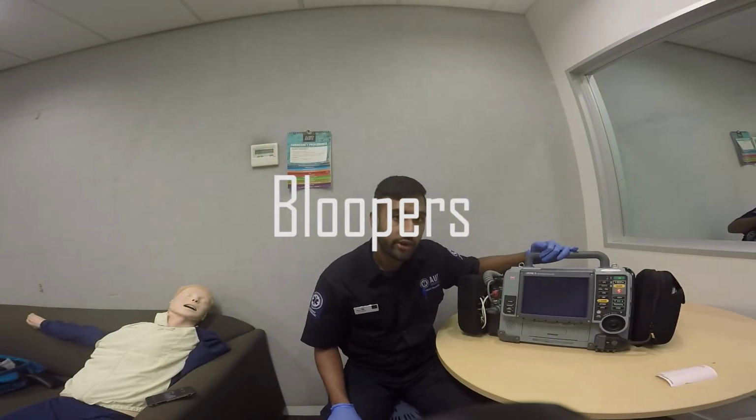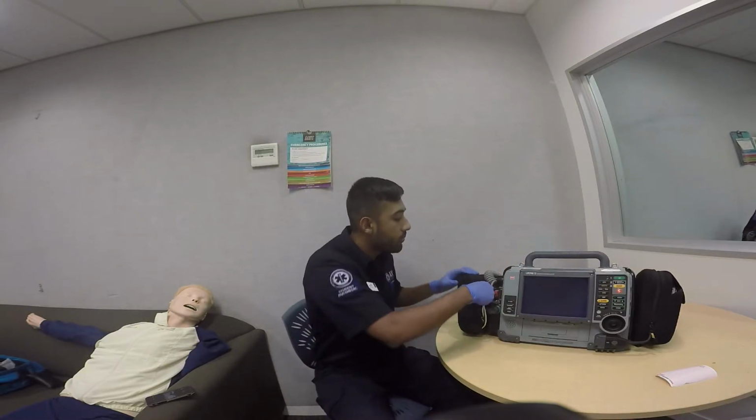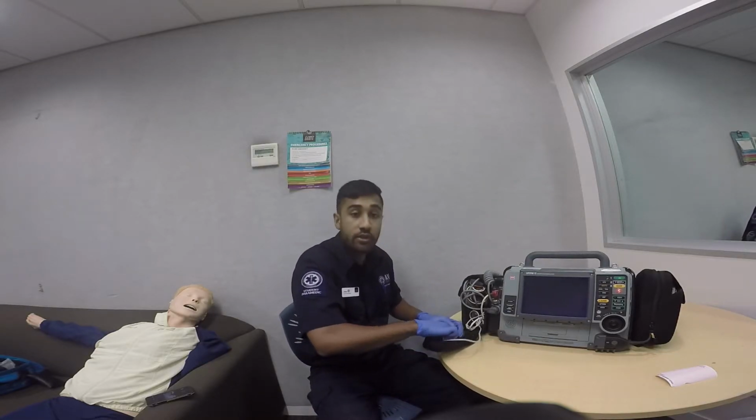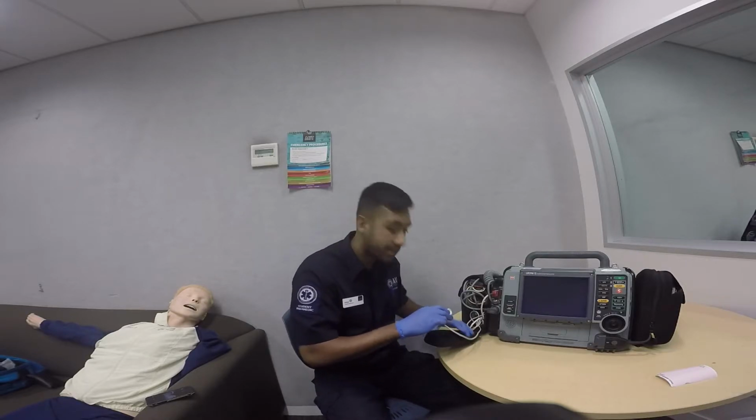This here is my Defib Orientation video. I'll be doing it with the LifePack 15. To start off, we'll be opening the right pocket. This pocket has the SpO2 monitor. It also has the ET CO2 detector as well as the 3-lead ECG.